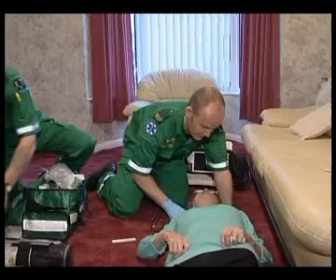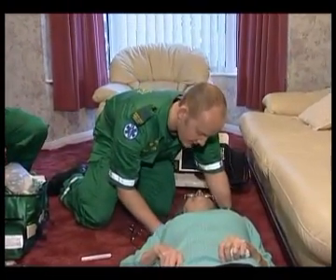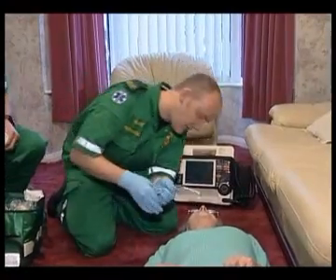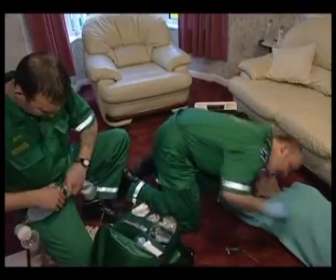Raising the shoulders allows the head to roll back, giving better access to the stoma in the neck. She's got a little blockage in here, I'm just going to remove it. OK, that's that.